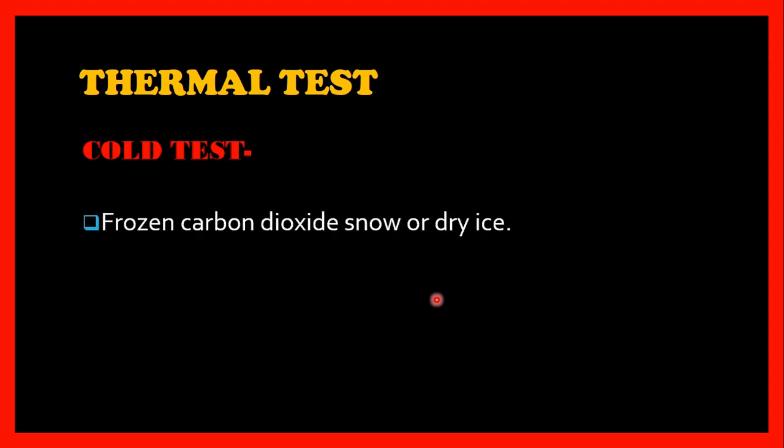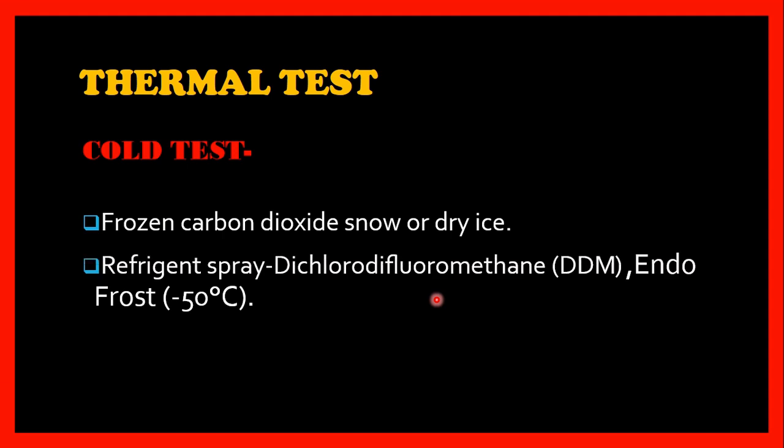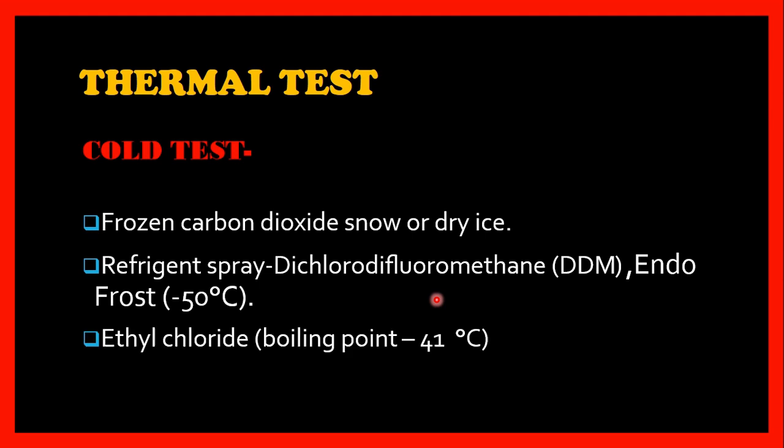Moving ahead, we have the thermal test. In the thermal test, either cold or heat stimuli are applied to a tooth to determine its sensitivity to thermal changes. The first test we are going to discuss is the cold test. It can be performed with frozen carbon dioxide snow or dry ice, or refrigerant sprays like Endo-Frost, dichlorodifluoromethane, and ethyl chloride.